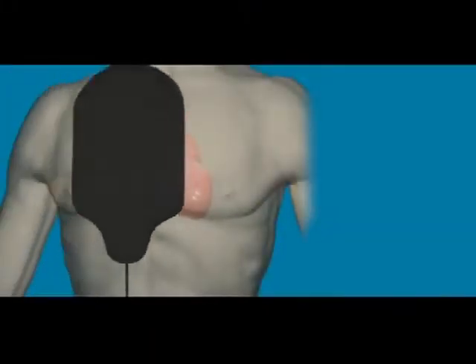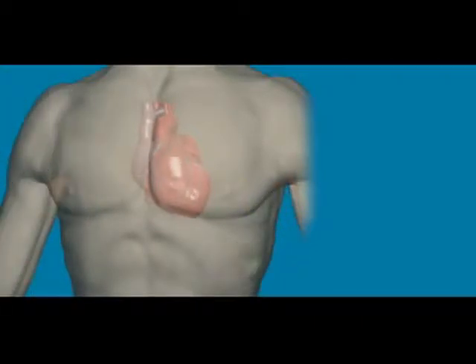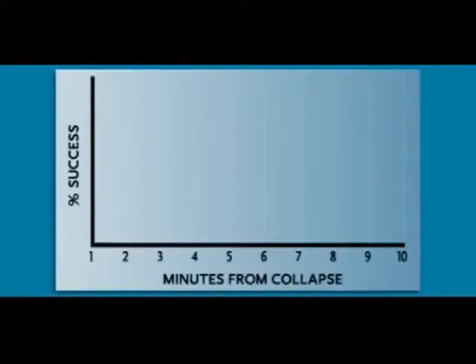The only way to stop ventricular fibrillation is with a controlled shock to cause the heart to restart in a regular rhythm. That's called defibrillation. Defibrillation is most likely to succeed if the patient is shocked within about the first 4 minutes after collapse. Here's why. When the heart stops pumping blood, the heart, brain, and other vital organs stop getting the oxygen they need. The odds of restarting the heart are going down about 10% every minute.